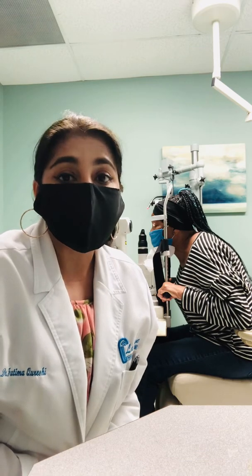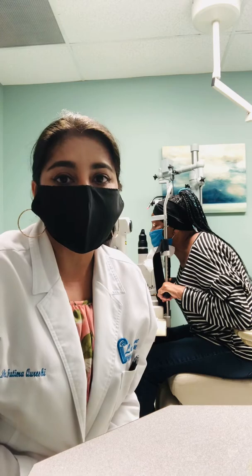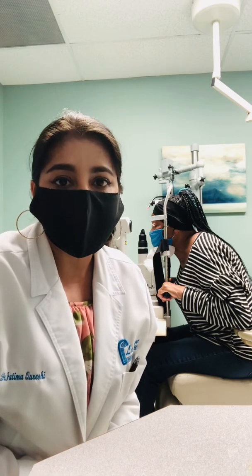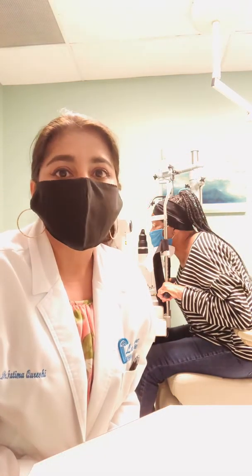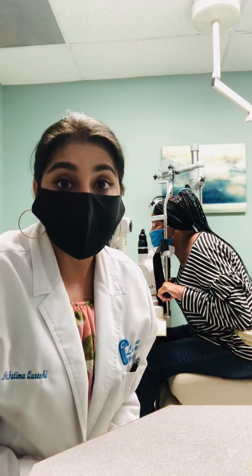So we numb the eyes. We also put some pilocarpine to make the pupils smaller so that I have enough room to make a hole. It's called LPI — laser peripheral iridotomy.